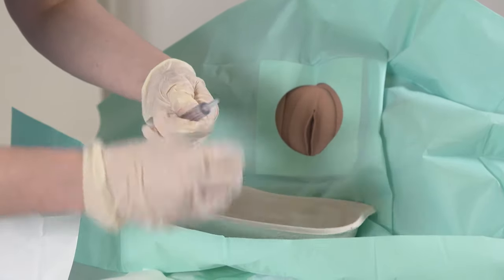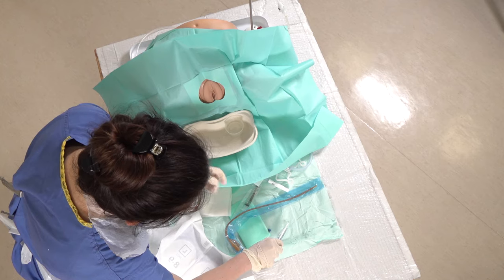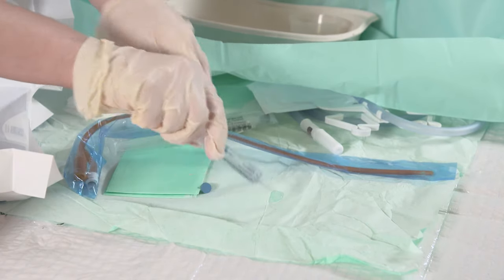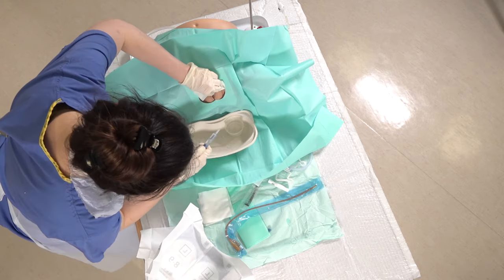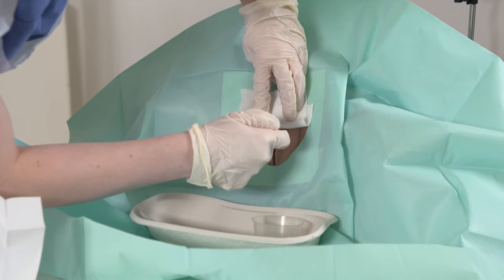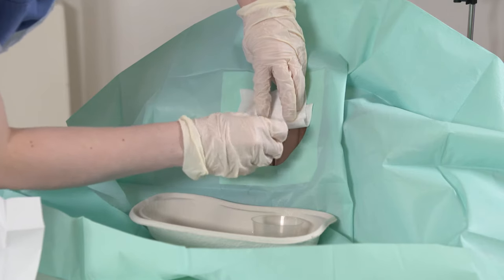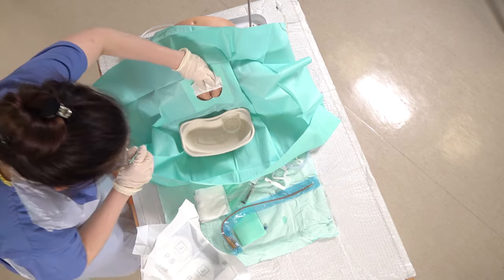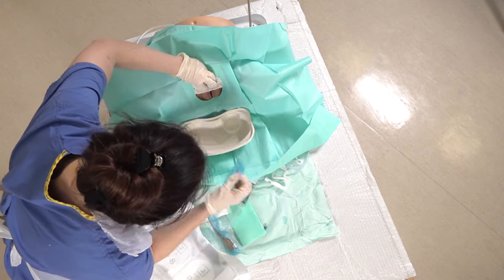Next we're going to numb the area using some instillagel, just placing a small amount on the drape — the sterile field — to use to lubricate the tip of the catheter. Then using your gauze again to hold the labia minora apart, you just insert a small amount into the urethra, then place that syringe in the bin so you let that work for a few minutes before placing the catheter in.